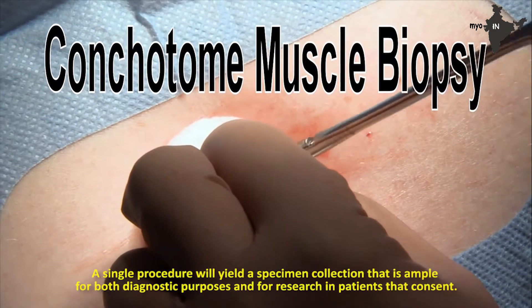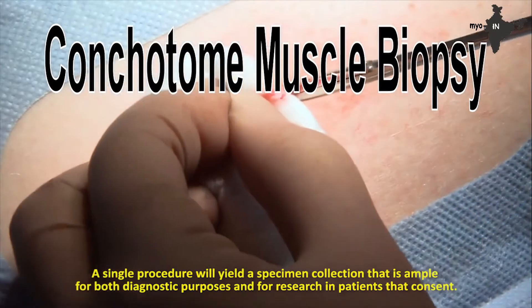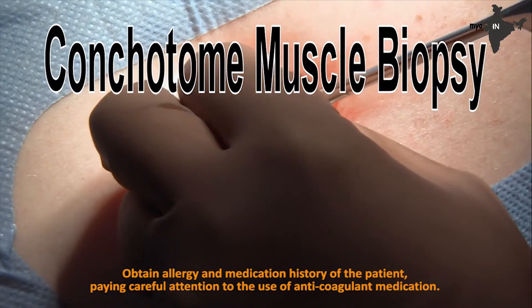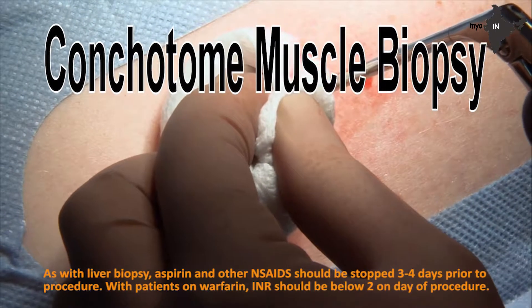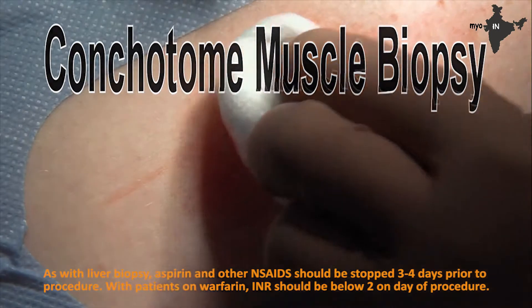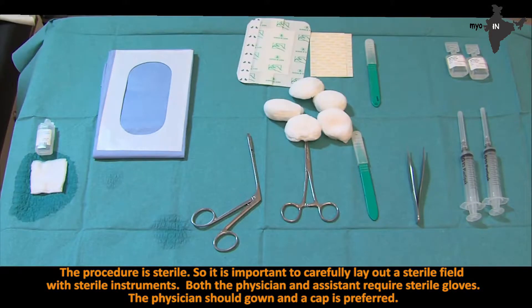A single procedure yields a specimen ample for both diagnostic purposes and research in consenting patients. Obtain allergy and medication history of the patient, paying careful attention to anticoagulant medication use. As with liver biopsy, aspirin and other NSAIDs should be stopped 3–4 days prior to the procedure, and for patients on warfarin, INR should be below 2 on the day of procedure. The procedure is sterile, so it is important to carefully lay out a sterile field with sterile instruments. Both the physician and the assistant require sterile gloves; the physician should gown, and a cap is preferred.